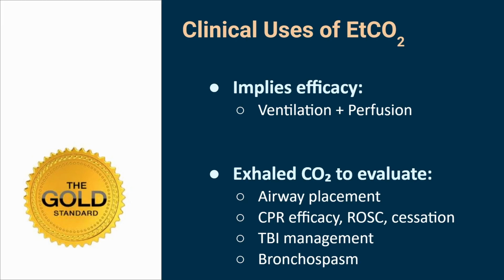Yeah, the idea is, I've only done two. They're not very popular, but when you get people that have lockjaw or trauma, you can't do an oral intubation. It's actually pretty anticlimactic, but super cool. As you're waiting to intubate the patient, you take the ET tube and just curl it up in your hand like this, so it gets this gnarly hook to it.